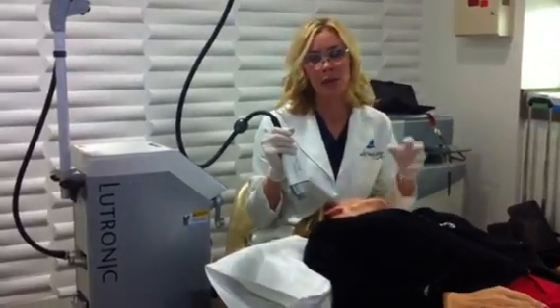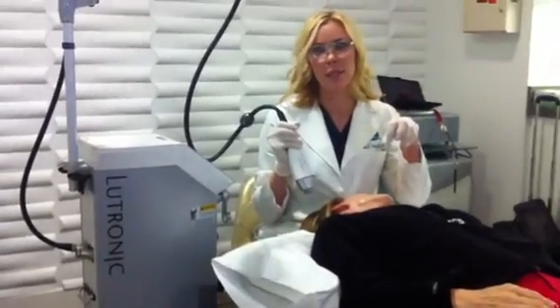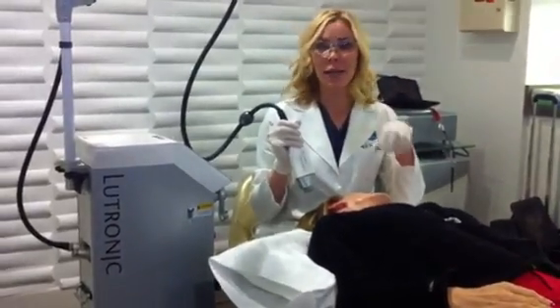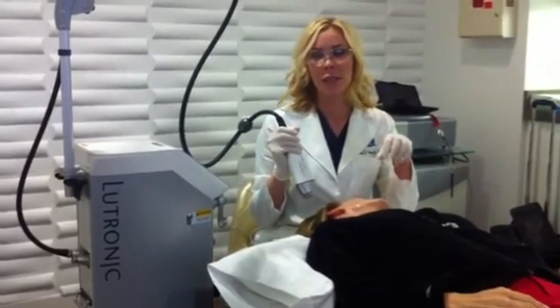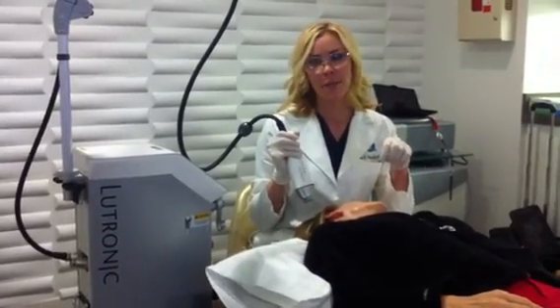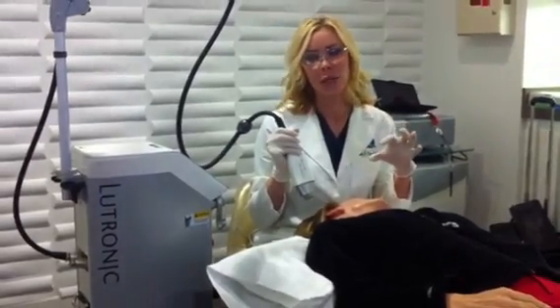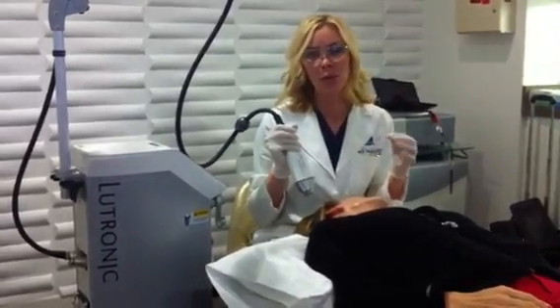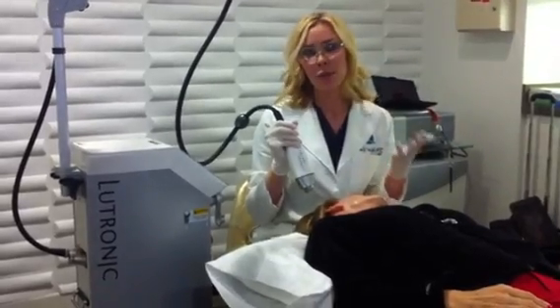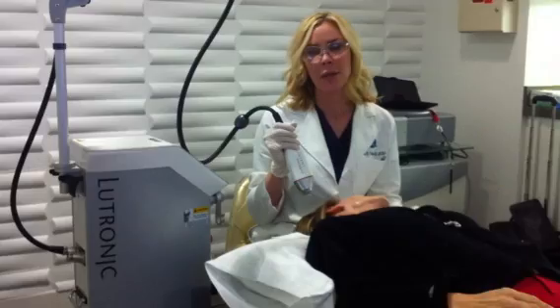So the way this works is little teeny, almost microscopic needles are deployed into the skin, and then the device fires and allows radio frequency energy to be deposited into the dermis, which is our second layer of the skin. This causes a thermocoagulation area, which is an area of controlled heat that then produces collagen and thus new supple skin and tightening over a period of weeks.